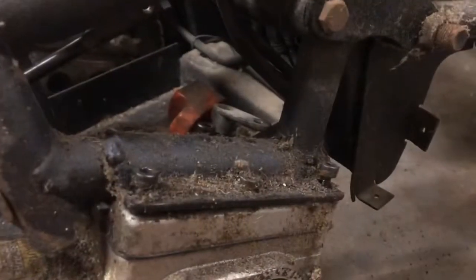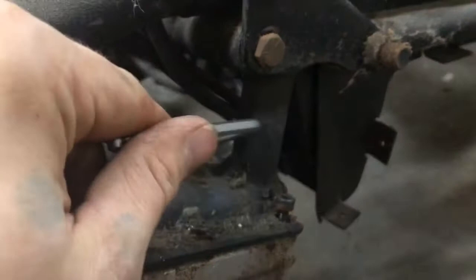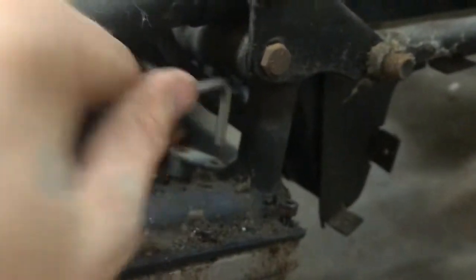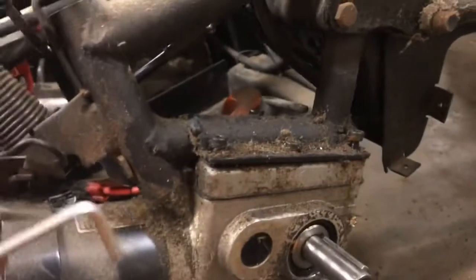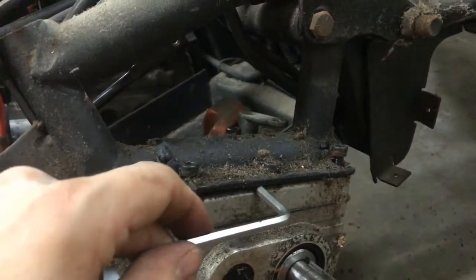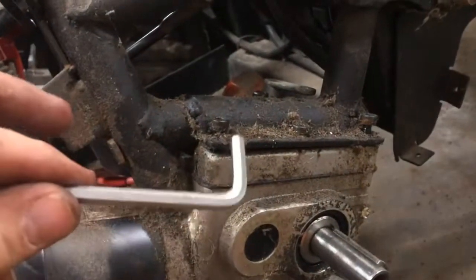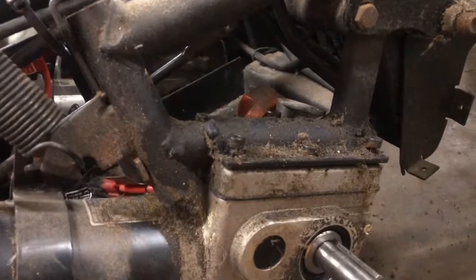So let me go ahead and loosen all of these. Okay, so I went ahead and loosened them just about all the way. I took this back one out because you want to do that one first. Now as we start loosening, you should start seeing a little gap here. This is the point where, if you're reselling the motor, you want to make sure you support this so it's flush against the plate.